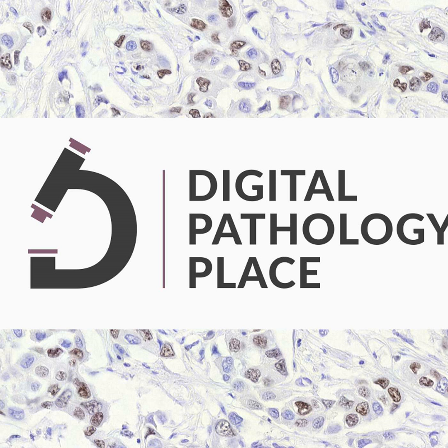But in AI analysis, there are significant correlations between Ki-67 and PHH3, which we would expect, right? Ki-67 is proliferation for the whole cycle, and PHH3 is mitotic figures. So there should be a correlation, right? The more cells are proliferating, the more mitotic figures we will have. And also, we had between PHH3 and P53. So P53 is the tumor suppressor. And if there's no tumor suppressor, there's going to be more proliferation. So less tumor suppressor, more proliferation, more mitotic figures.